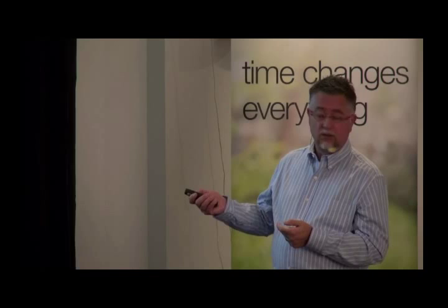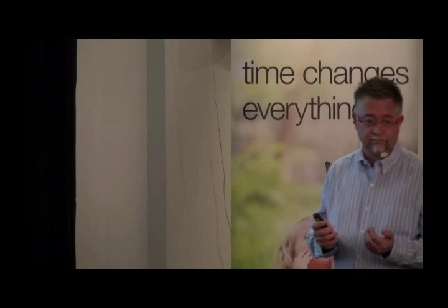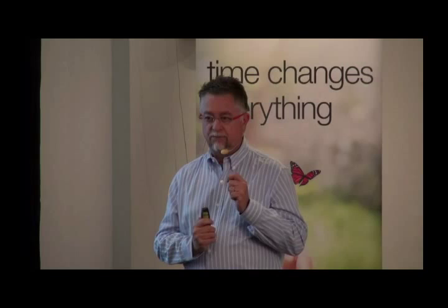And that is, again, because the instrument is counting almost 18,000 cells and we're counting, on a good day, 400. Make sense, you guys? So the message is, when you see those asterisks, please, please, please pay attention to them, all right? And what I came to realize is that when the ProCyte flags something, you better look at that smear because the instrument is really, really good at it.